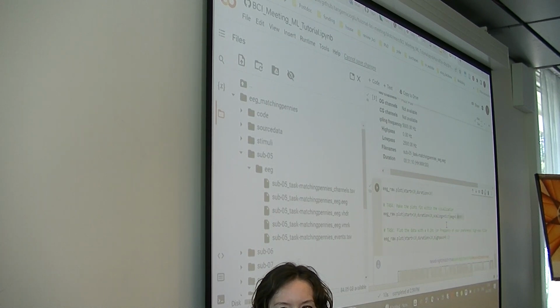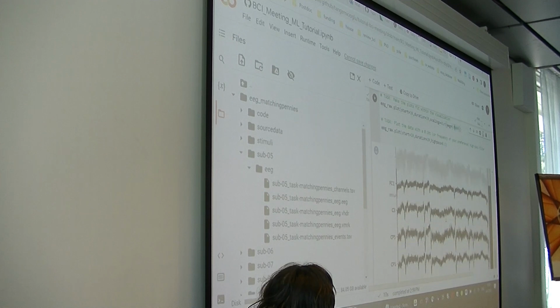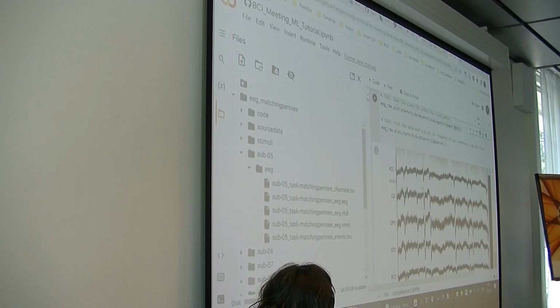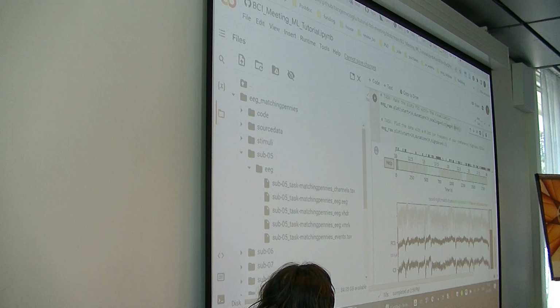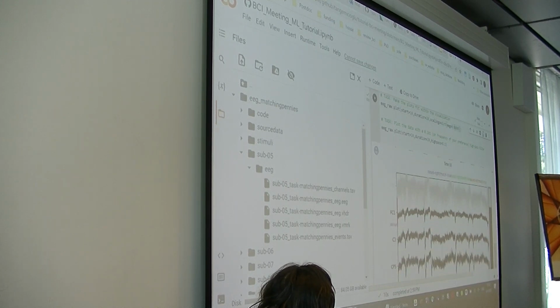There will be a lot of trial and error in deciding what value you want to choose for these. As long as you can see all of the data without it cutting to the top, you should be fine. And you don't need to care about the bad channels because they don't provide meaningful information.